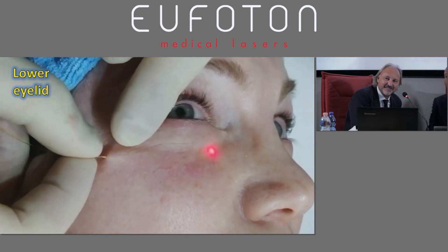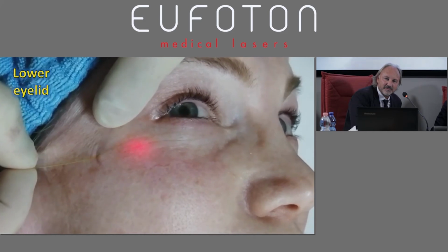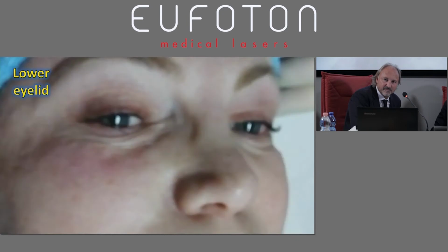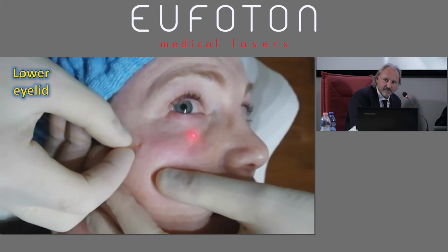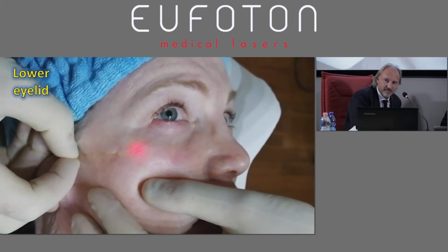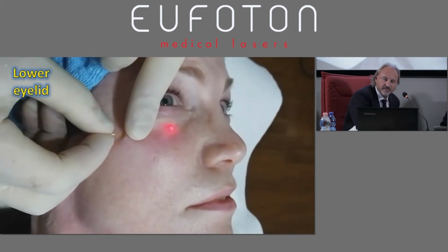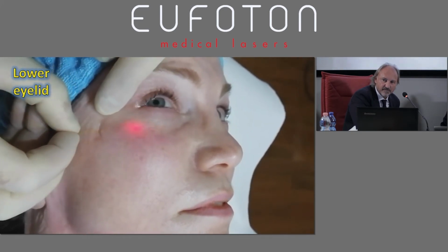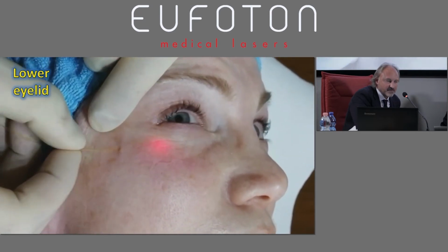First question: we have seen that in some selected cases, when the patient feels a bit of pain, we do some dry anesthesia, not to get any heat dispersal. But the more the tissues are imbibed, the higher the water content is, so more energy is absorbed by the tissue. According to the timing in which you let the tumescence and the action of the anesthesia act, do you modify the initial parameters, do you decrease or increase, compared to those you would have used without the anesthesia?